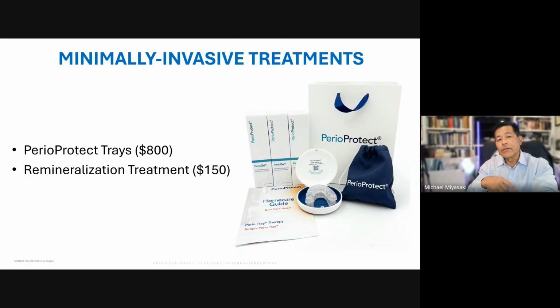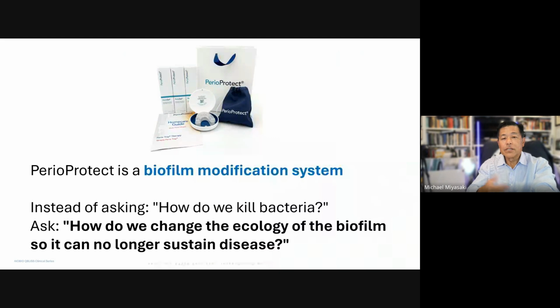How does it help our revenue? When our patients say yes, they're interested in Peri-Protect trays, the trays, the scan, the fabrication, and what we charge is $800. So again, it helps us because we're providing our patients with a very minimally invasive treatment, and it generates revenue.